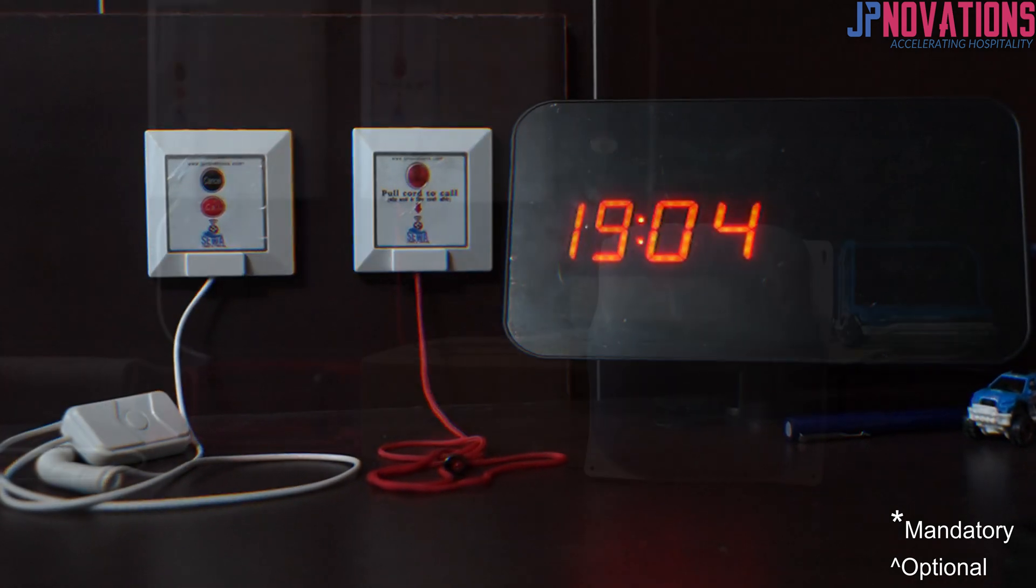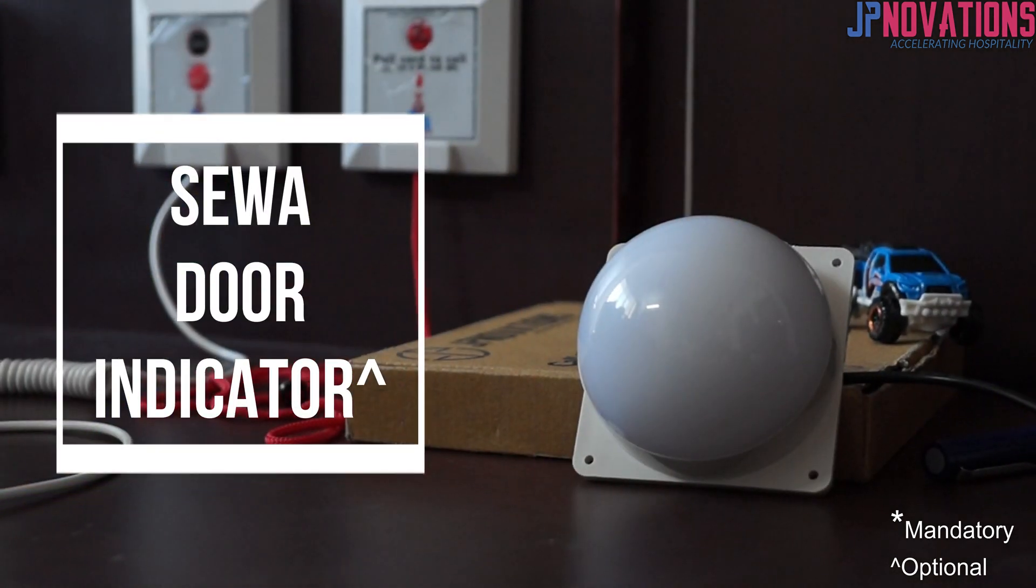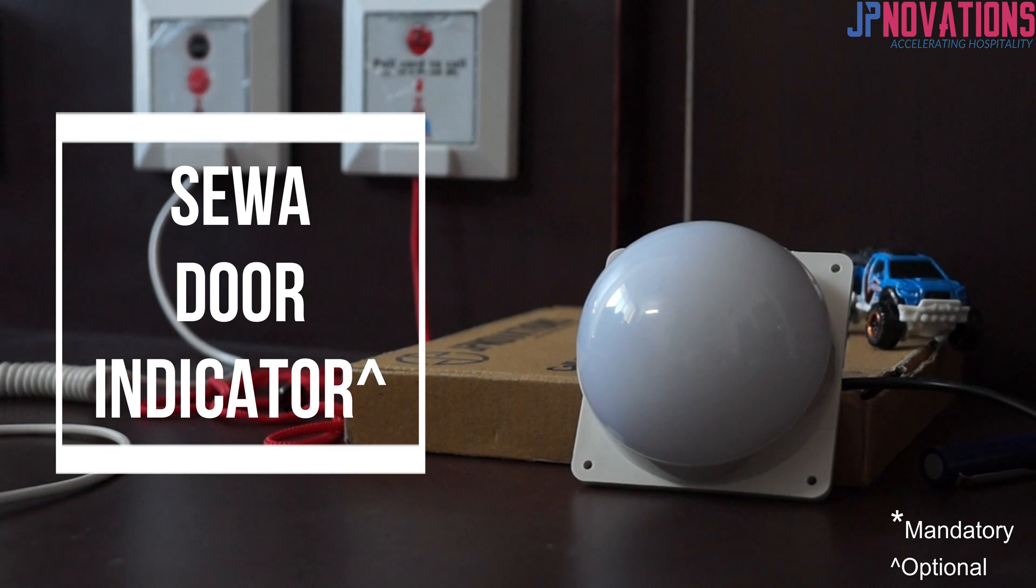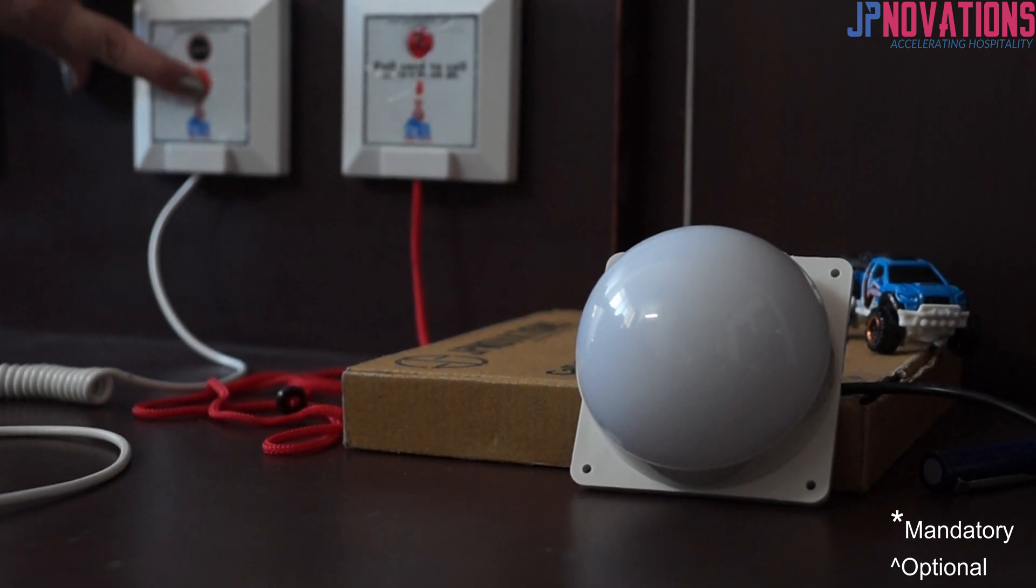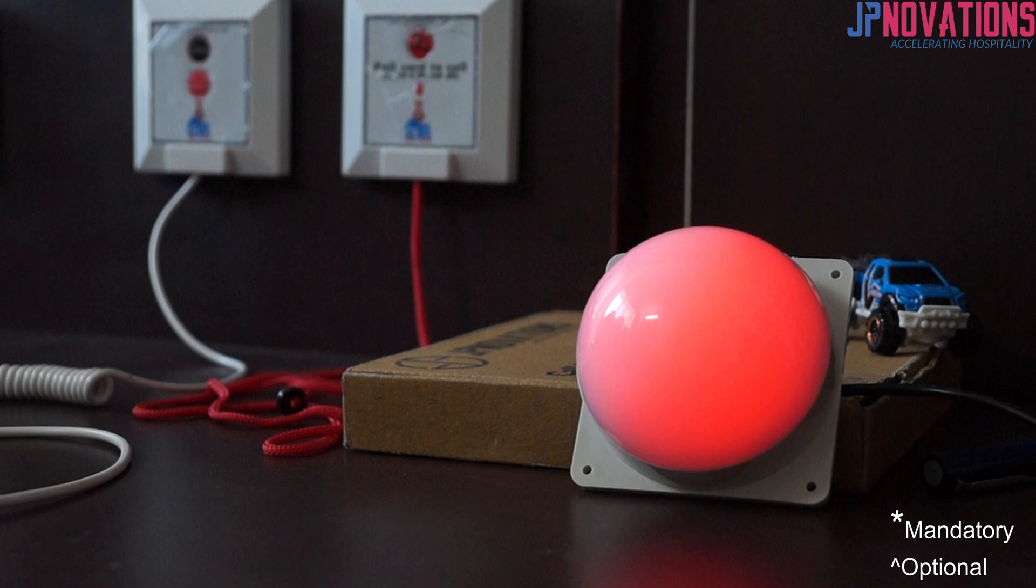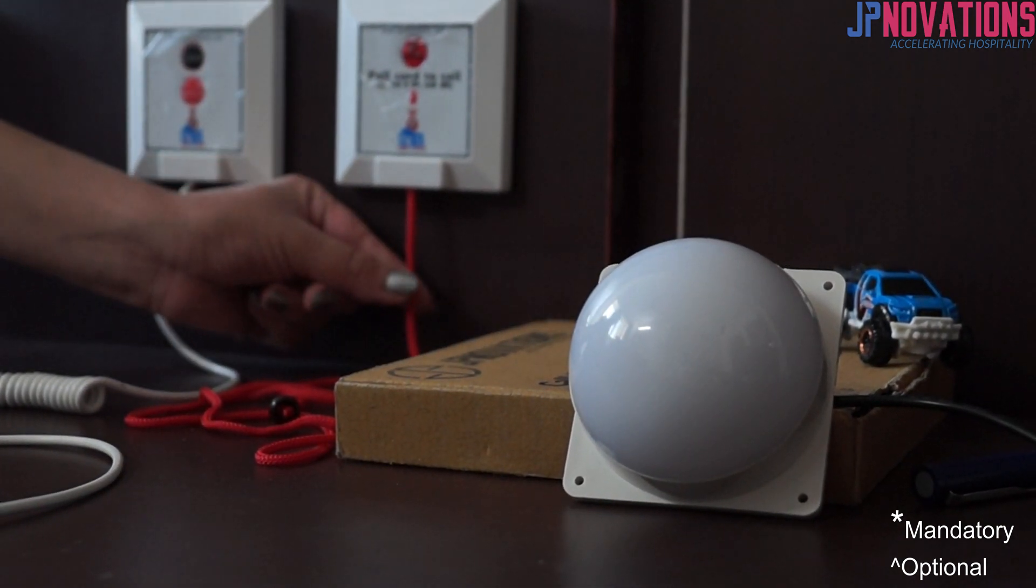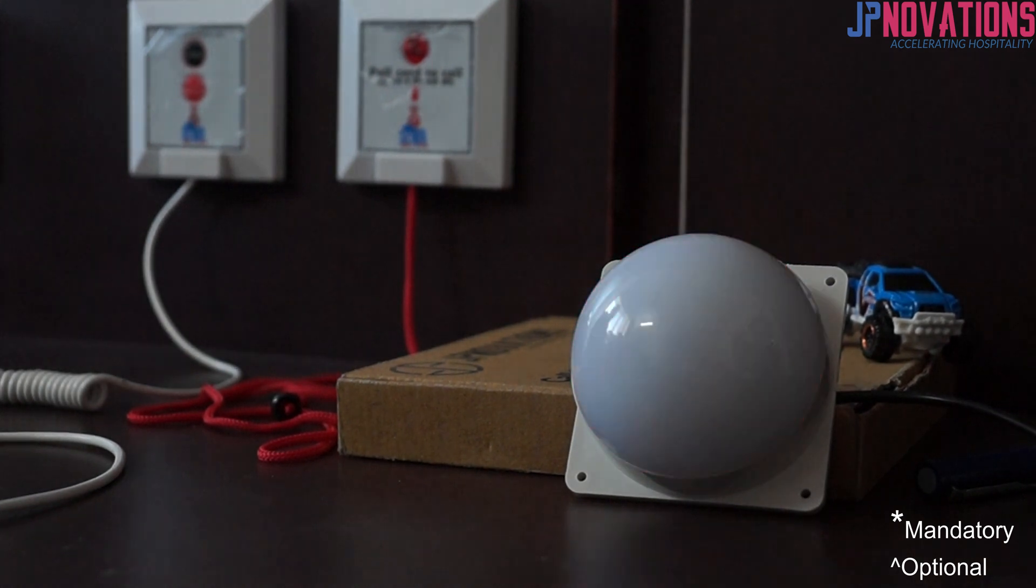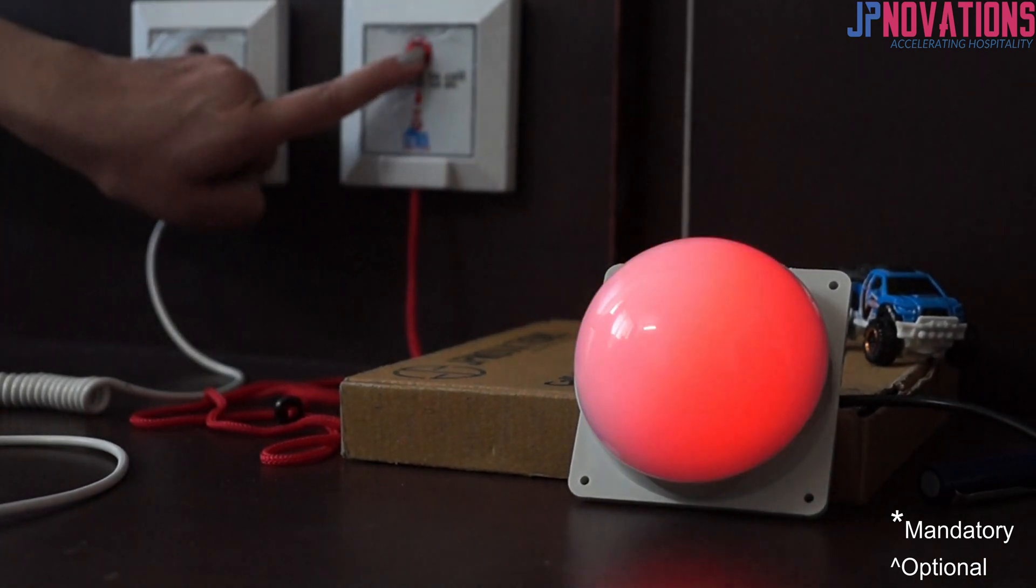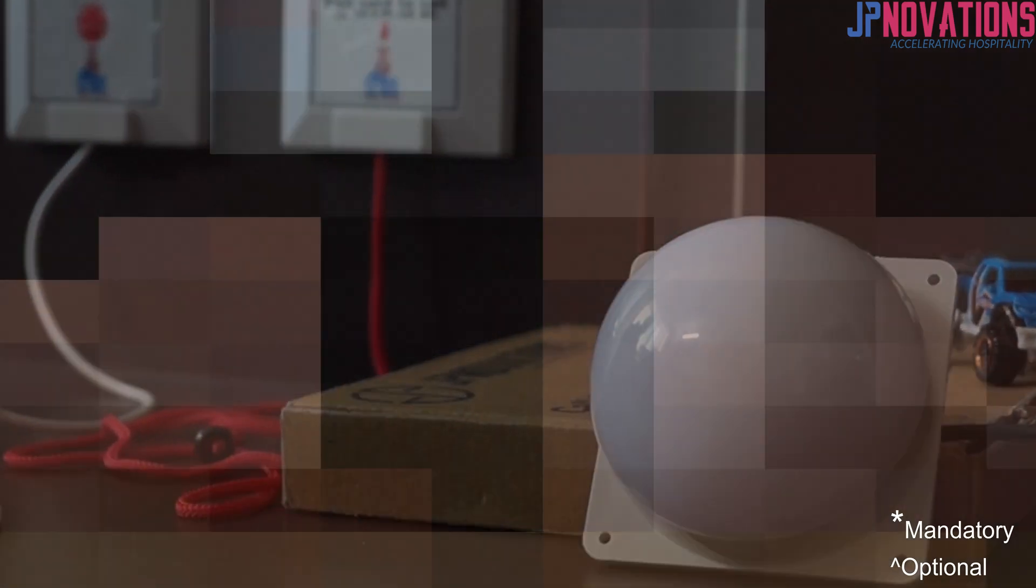This is a door indicator which glows when call button from respective room is pressed, and on attending the call light goes off. It is installed outside the room which helps in knowing that there is a pending call when staff is passing by the room. It helps in saving time of the staff.